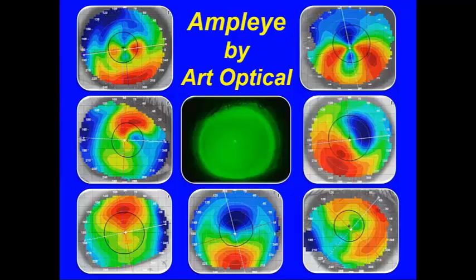Okay, here's one. One of my patients has had glaucoma surgery recently, or filtration surgery. Can this be used on these patients? It can be, but it's going to have to be modified. What we'll frequently do is go to a smaller diameter lens design, to a 14.5 millimeter lens design.